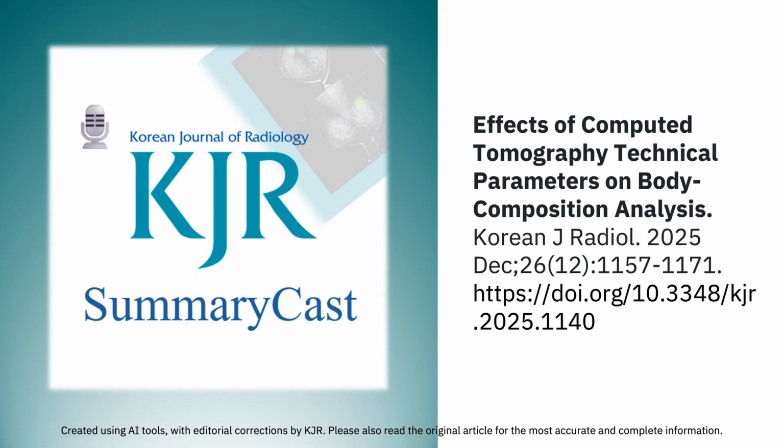The review focuses on advanced scanners, particularly dual energy CT and photon counting CT. Dual energy CT, or DECT, is interesting because it offers a potential solution to the contrast problem, virtual non-contrast images. That's the promise. You do one contrast-enhanced scan at 2 energy levels and then computationally subtract the iodine signal to create a VNC image. This avoids the radiation dose of a true non-contrast, or TNC, scan. So can VNC images substitute for TNC images for body composition analysis?